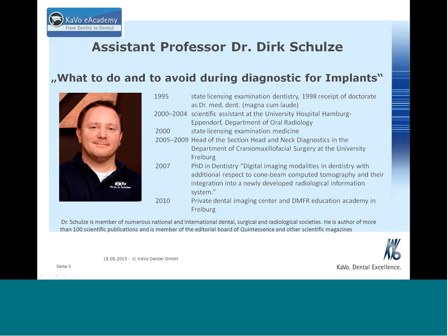Right now, we can say that the CBCT machines become better and better with regard to the depiction of one single implant. So today it is possible to view all the bone around the implant, so these kinds of artifacts can be avoided in the future. The problem will occur again when at least two implants are placed side by side.